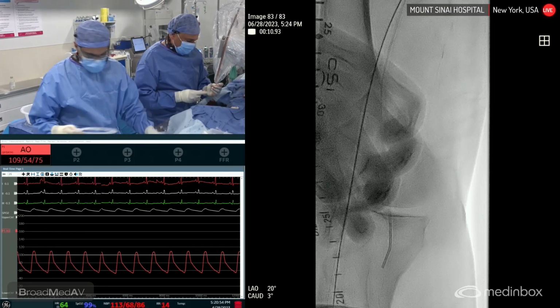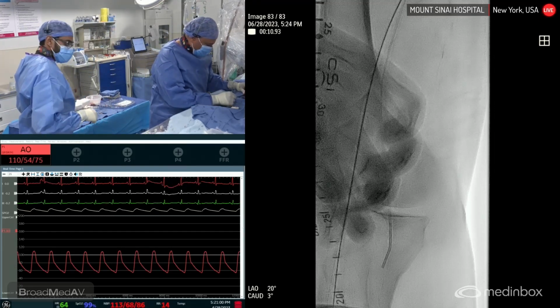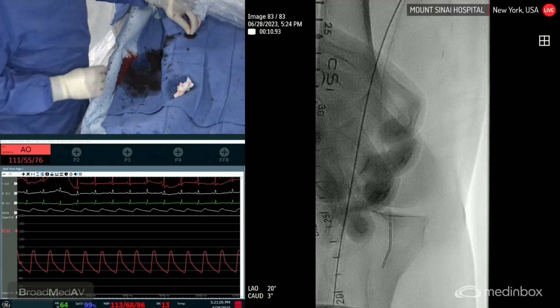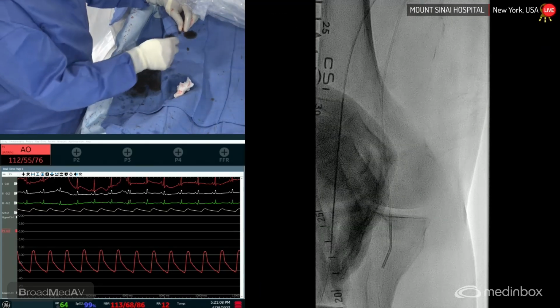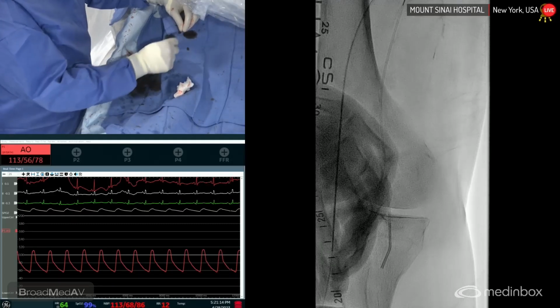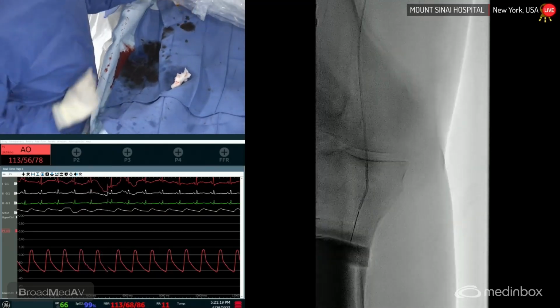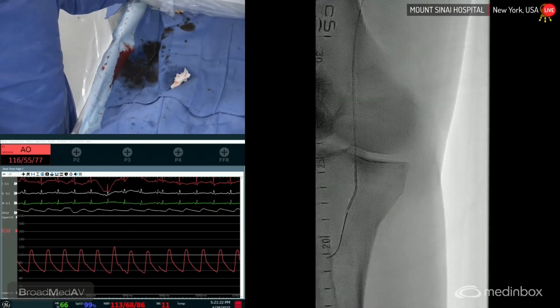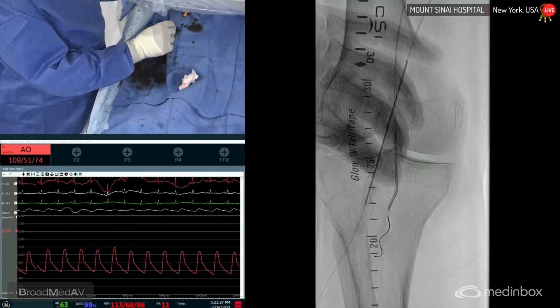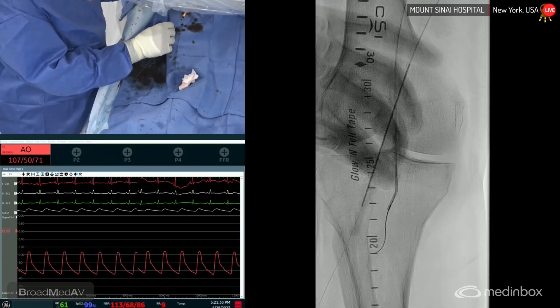When you put this wire in, you have to be very careful because you want to make sure that the tiger side of the wire, there's one side of the wire that has the tiger stripes, is the distal one. The proximal part of the wire has a little golden nugget on it that prevents the filter from migrating. The beauty of this wire is that the movement of the filter is independent of the wire, which prevents the filter from moving while you're doing complex interventions with atherectomy, and so on and so forth.